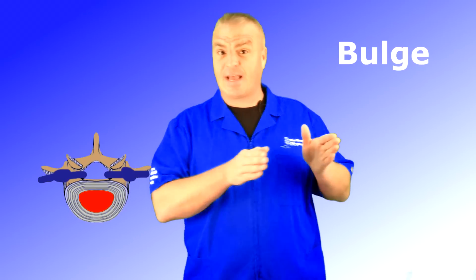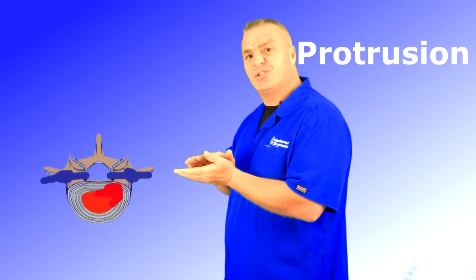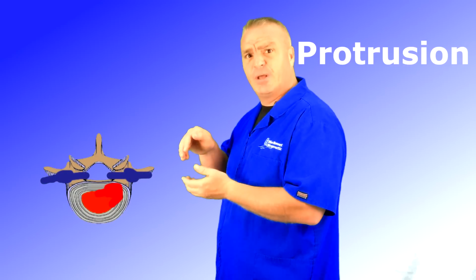All right, so let's go to the next level. On the MRI, it's going to say person has a posterior lateral or some other term that's going to define which way the disc is bulging. And if the word is a posterior lateral disc bulge or posterior lateral disc protrusion, it's going to look more like this here. And you can see it's just a continuation a little bit longer.